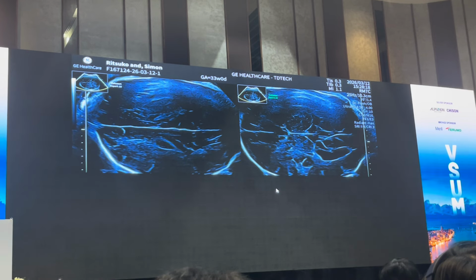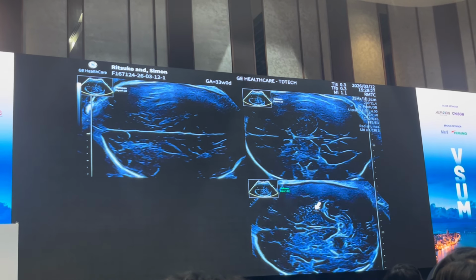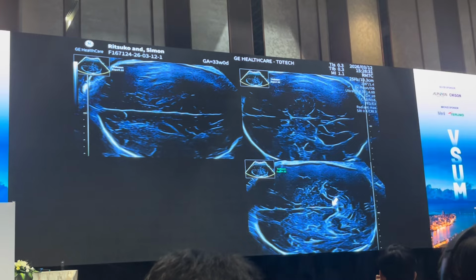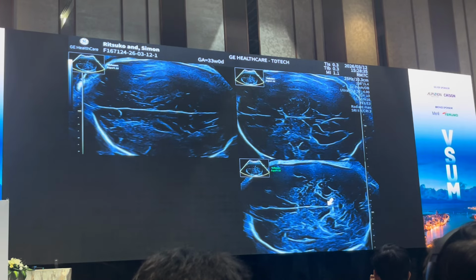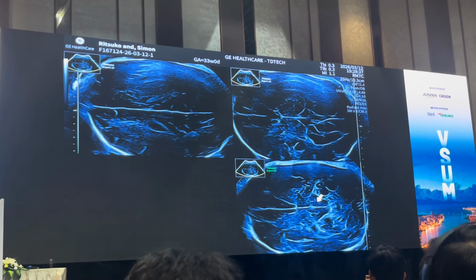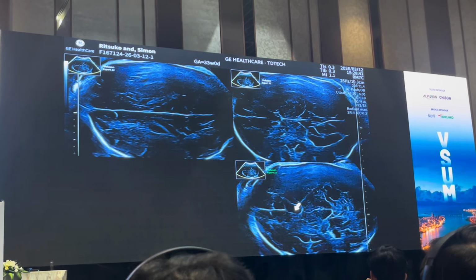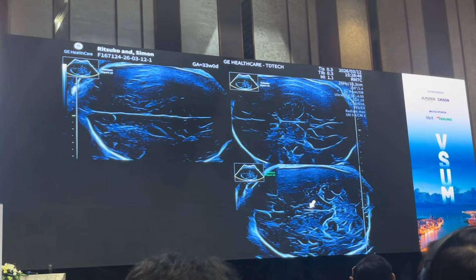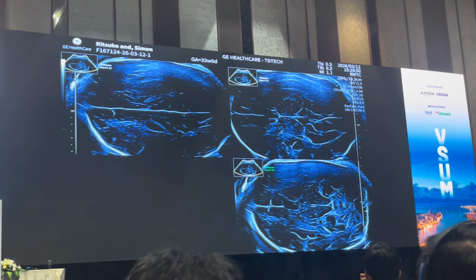And then the next after that is to update my image and come down to the cerebral peduncles, this tiny little slit in here, the aqueduct of Sylvius, which is very hard to see in this late stage. These are the cerebral peduncles, these are the thalami, and then I need to get my cavum septum pellucidum in view. So I have to have my CSP and my cerebral peduncles. This is the point at which we take the BPD measurement.